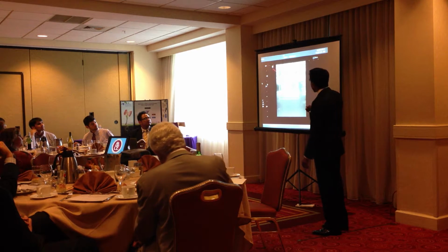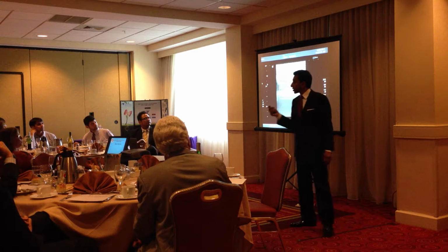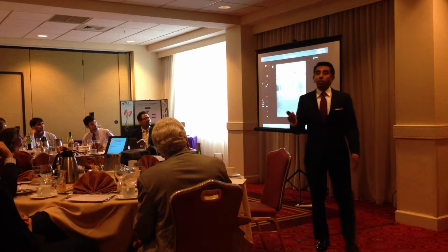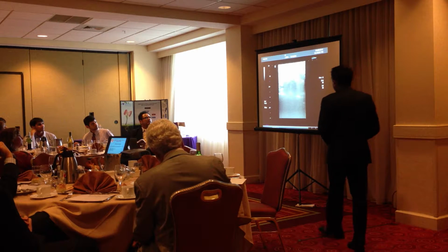In this case, it would have been easier for me to come right here. But then I would have hit this vessel right here, and then I would have potentially contaminated my specimen with additional blood, which is not what we want to do. So here I am performing the FNA.